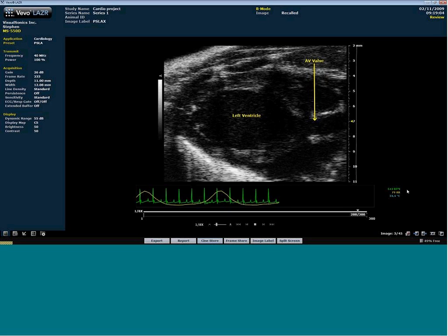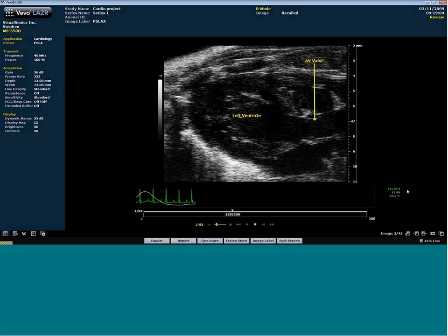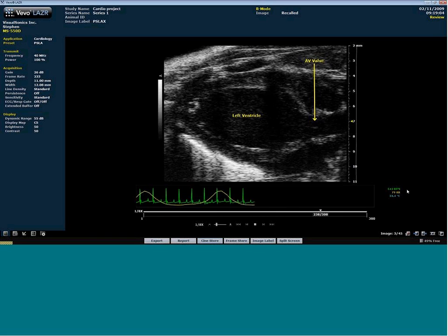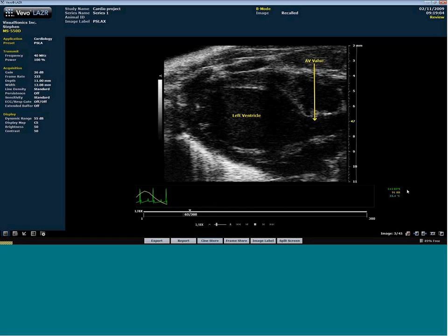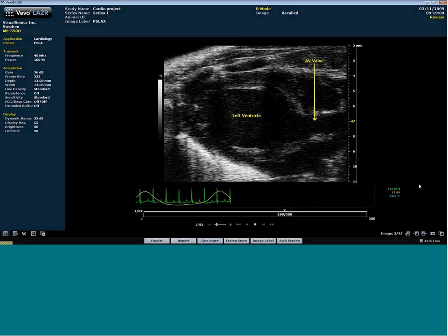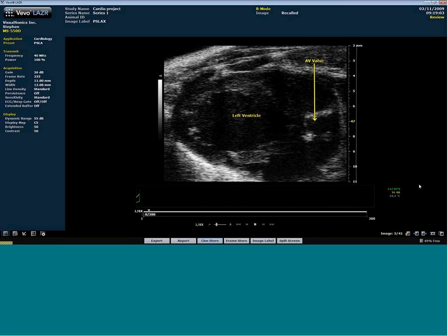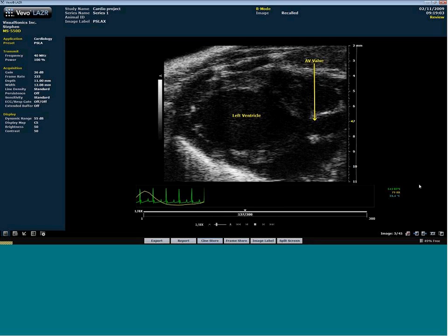If anything else, you can almost ignore, for lack of a better term, the heart rate. If you maintain the body temperature within a fairly tight range, the heart rate and the physiology will follow from there. So those are really important things for being consistent. Just monitoring that physio data and really trying to keep it consistent.